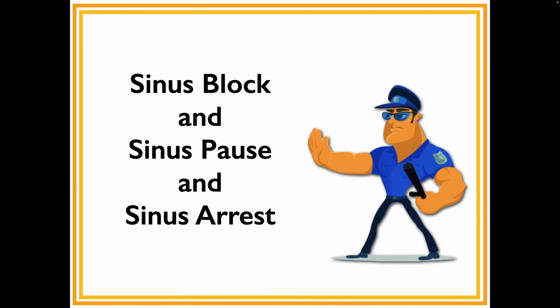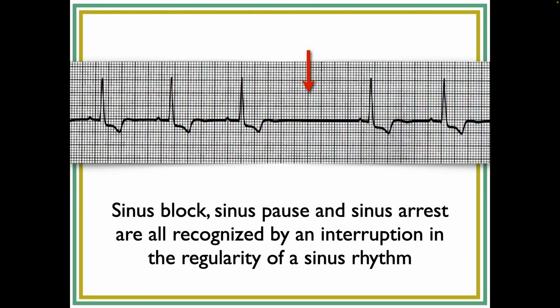Sinus block, sinus pause, and sinus arrest. So sinus block, sinus pause, and sinus arrest are all recognized by an interruption in the regularity of sinus rhythm. So in this case, is this regular or not regular? Well, if you were to take your calipers, I think you would find that the underlying rhythm is regular, but then there's this pause in the middle of it, okay? So what is that pause about?